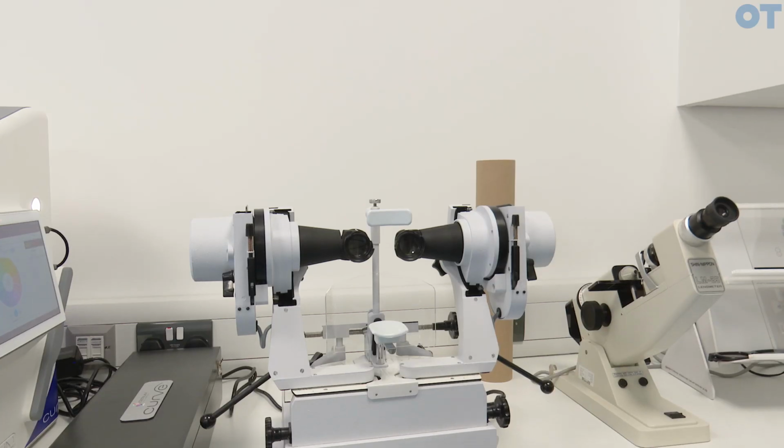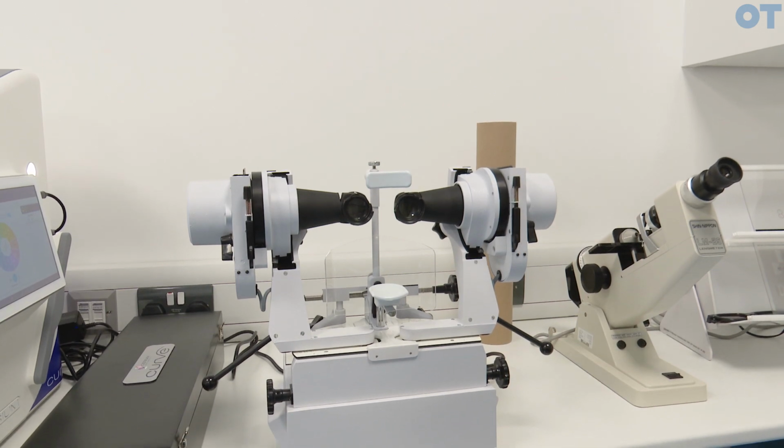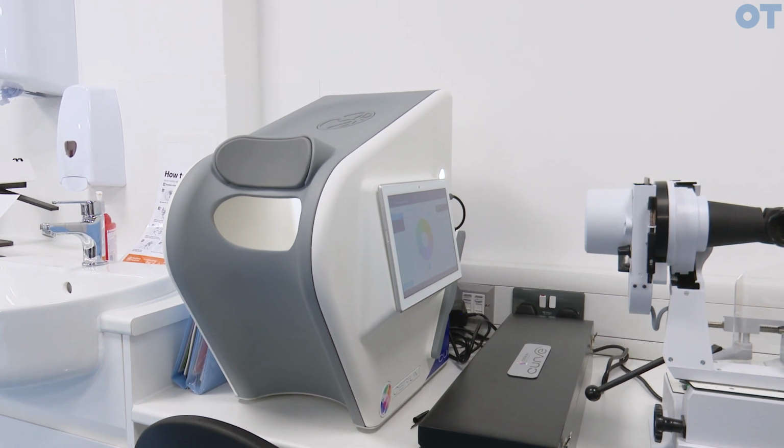We additionally have certain instrumentation for the detection and management of binocular vision anomalies. So we have a dedicated orthoptic training kit. We have a synoptophore for both diagnostic and training for orthoptic techniques. As well as that, we have a colorimeter for the diagnosis and prescribing of lenses to alleviate visual stress on the patients. Within the sight testing bays, all sight testing bays are set up with this digital ready slit lamp.